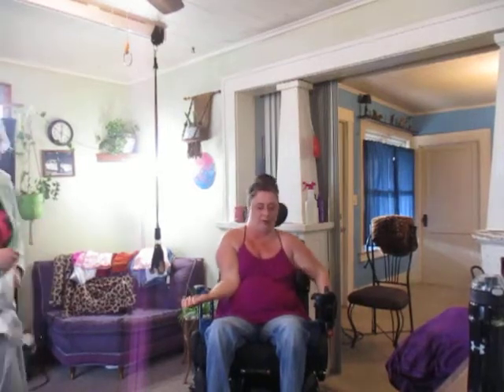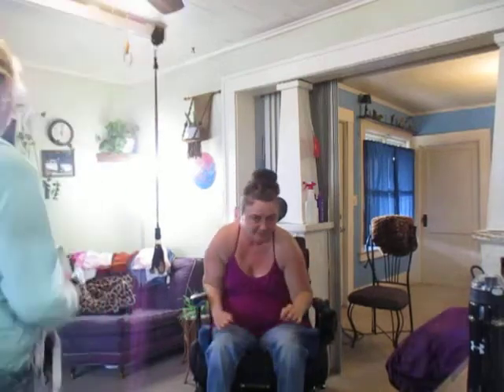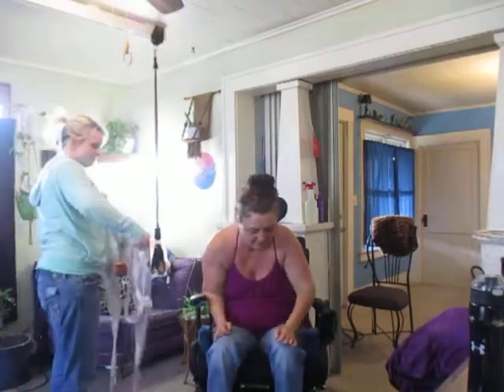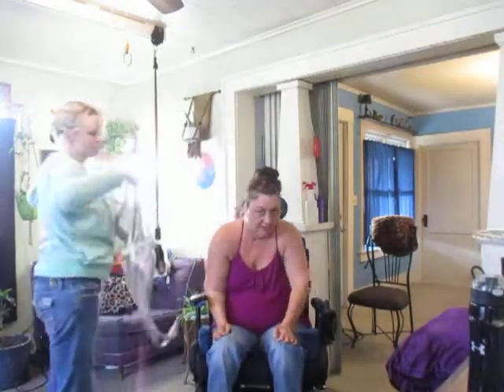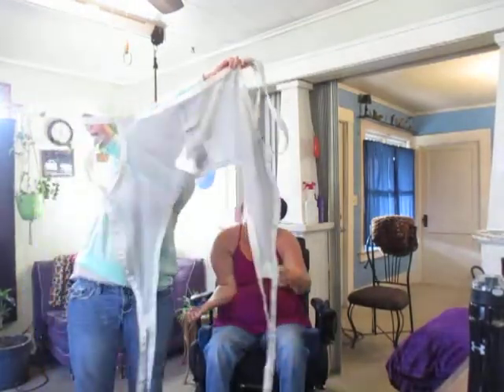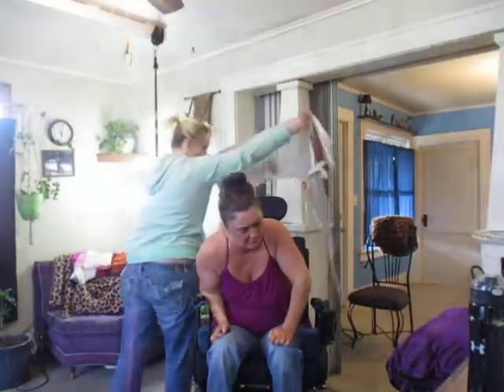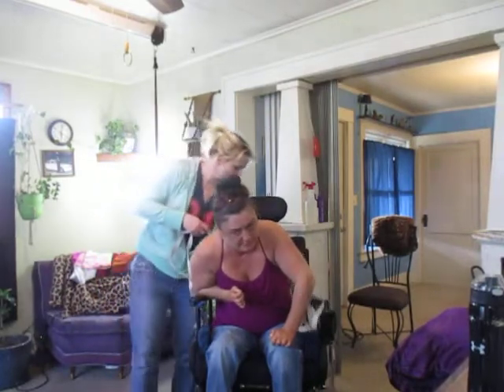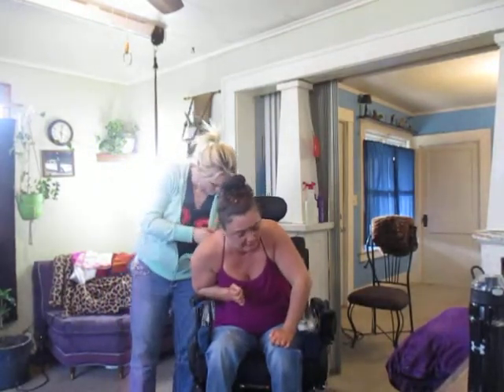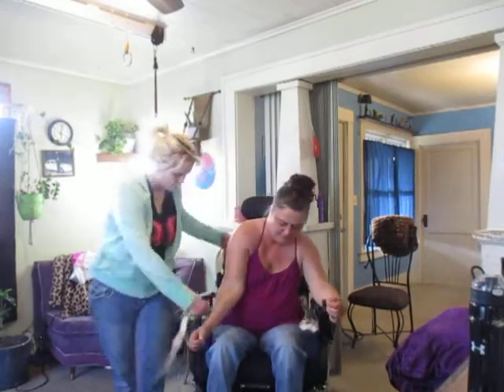I'm going to sit forward. There it came down. I'm going to sit forward, and I have them lifted up. Show them the sling that we're using. This is the type of sling that I use. It came with my Waverly Glen ceiling lift, but I will have them drop it down behind me and take the piece that goes around your butt. I have them tuck it only to the cushion, and then I'll have them bring the leg pieces around the side.